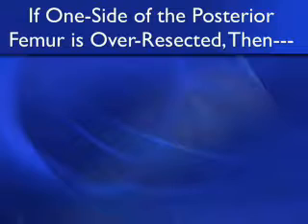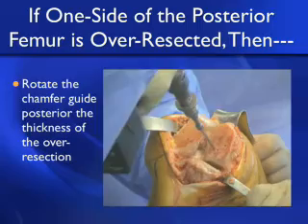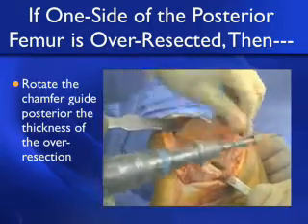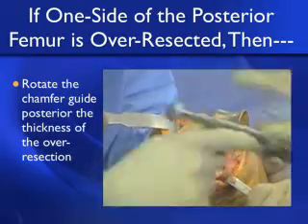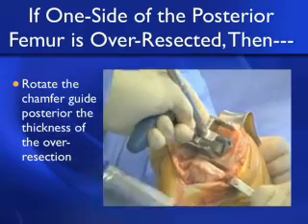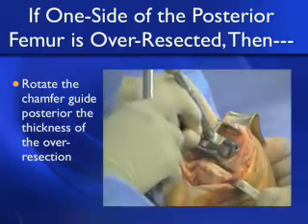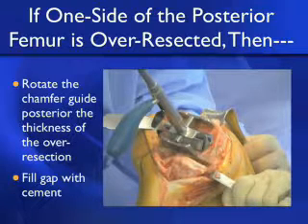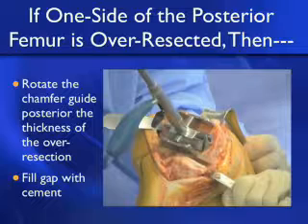If one side of the posterior femur is over-resected, you can simply rotate the chamfer guide posteriorly by the thickness of the over-resection on that side. Here we eccentrically move the pinhole a little more posteriorly because we've taken an extra 2 millimeters off posterior medial, then tap the guide in place, pin it, and fill the gap with cement. You have the ability on both the distal and posterior cuts to adjust the position of the component by 1 to 2 millimeters to fine-tune the kinematic position of the femoral component.